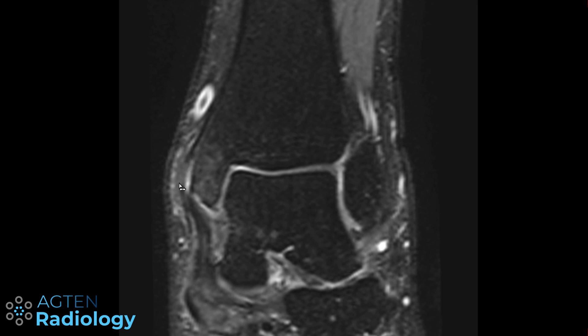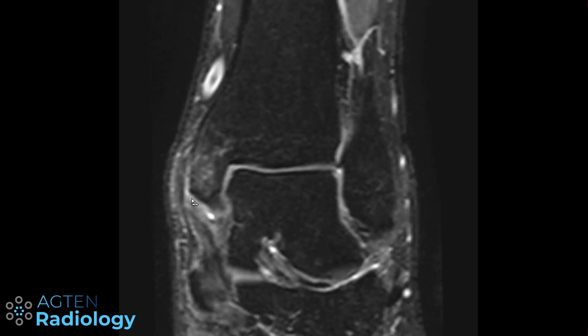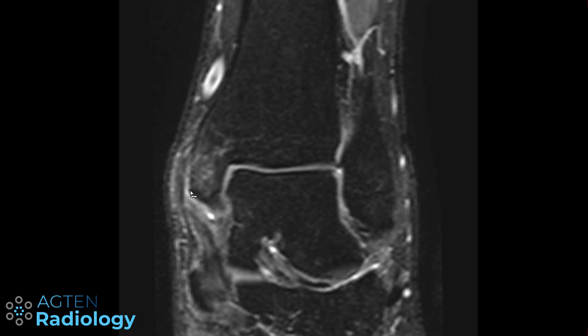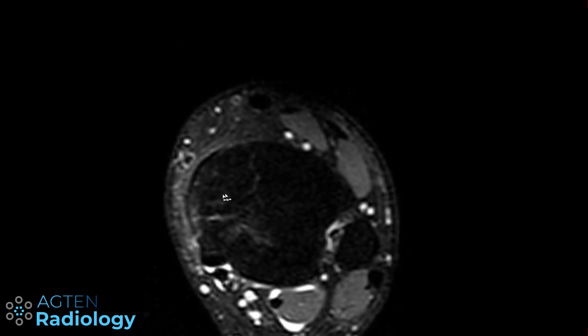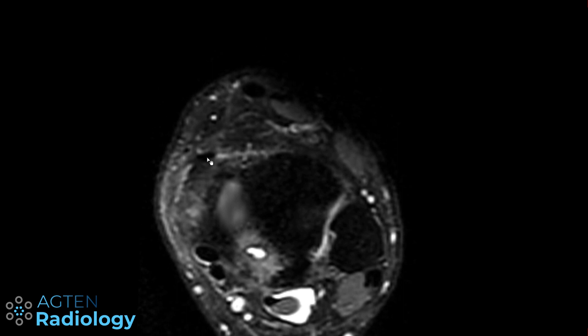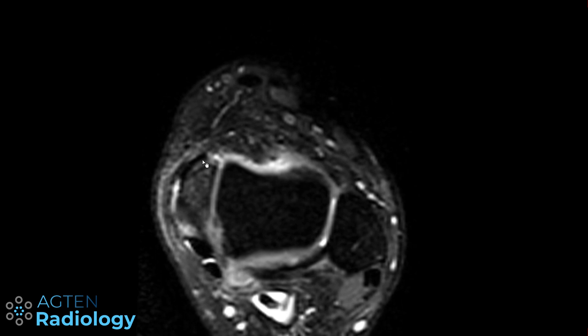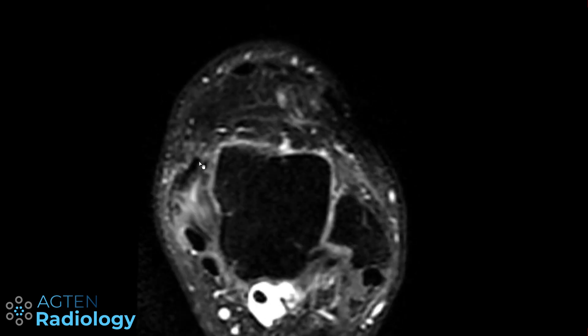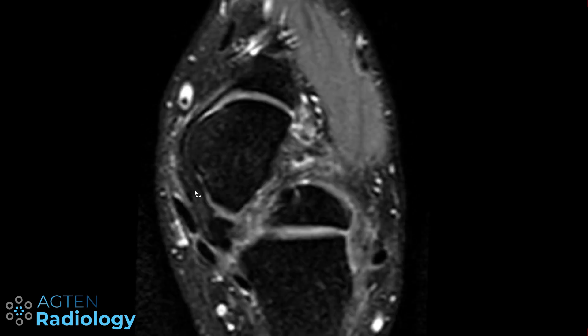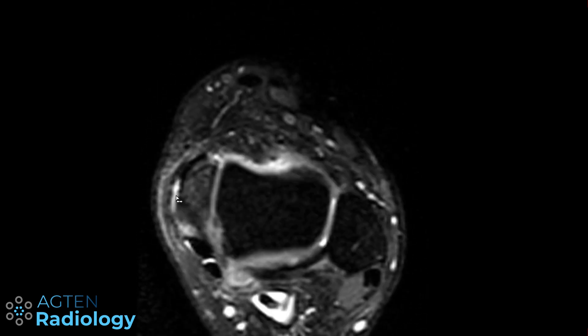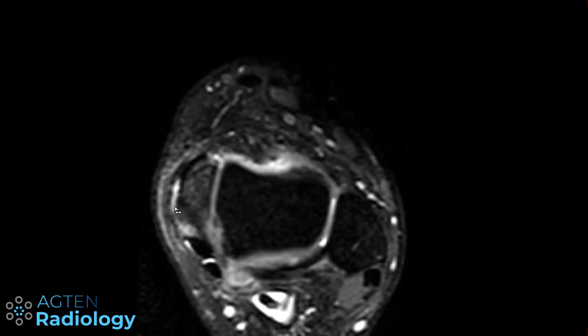The periost should be attached here and these ligaments should attach here — not going up like this. On the transverse section you can see the fluid here, the ligament still inserting onto the bone at the most anterior portion — probably part of the tibionavicular ligament — and then also a portion of the tibial spring ligament. The periosteum is stripped off together with the flexor retinaculum and we have fluid in between.